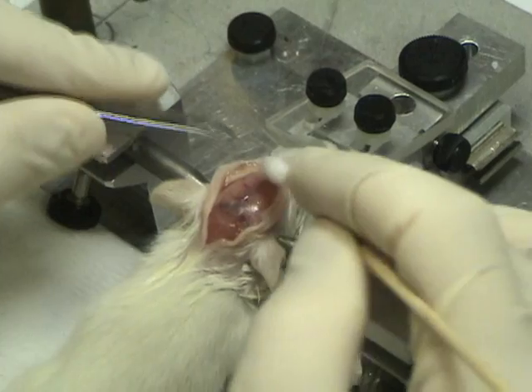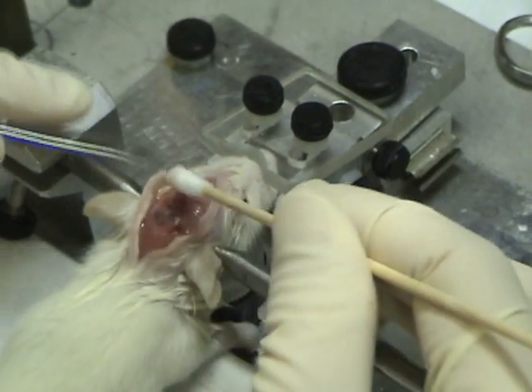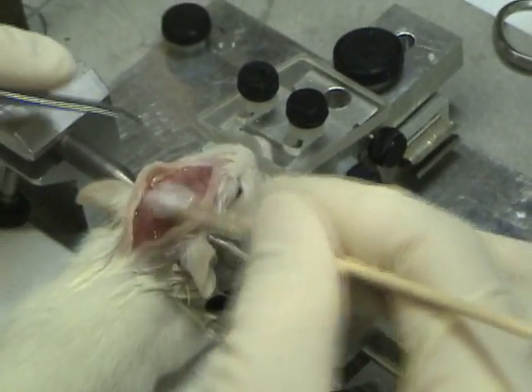Remove all sticky things on the scalp. So you shaved it before, right? Yeah. And this is your first incision, right? Yeah.